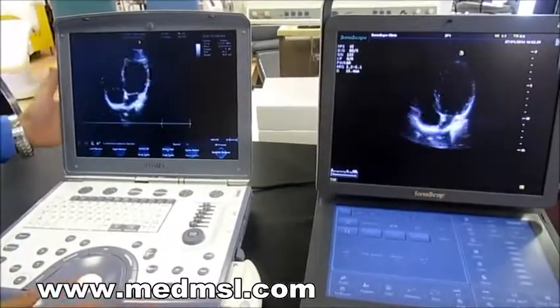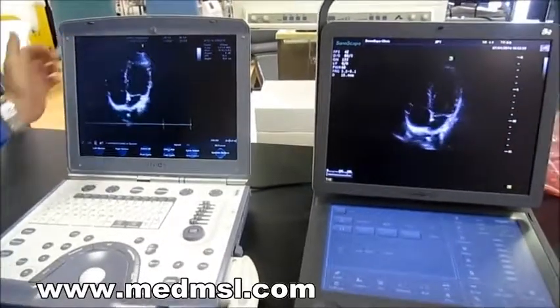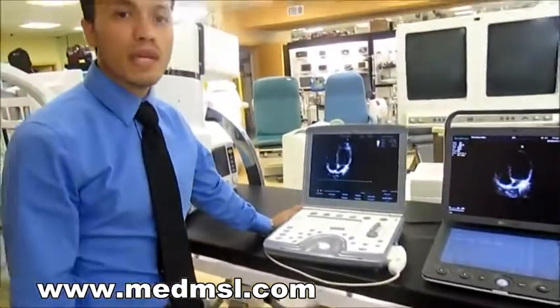This is a 2009 model and the screen is already starting to go flimsy. A repair like this from GE is going to cost you a lot of money out of pocket — something that your office really doesn't want to face.